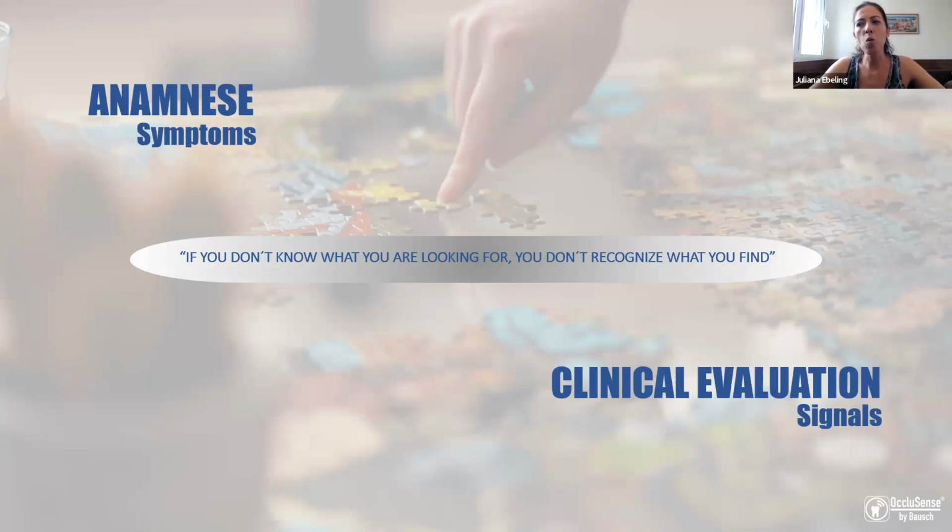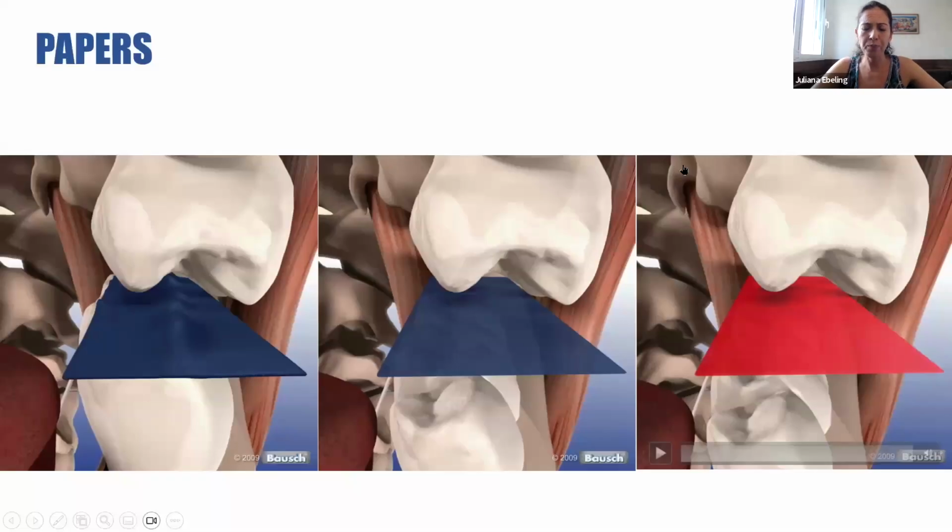If I don't know what I want to get with OccluSense, the device will bring me so much data that I will not be able to interpret and understand it. So the OccluSense session starts before, by asking what I'm looking for. Okay, this is really, really important.